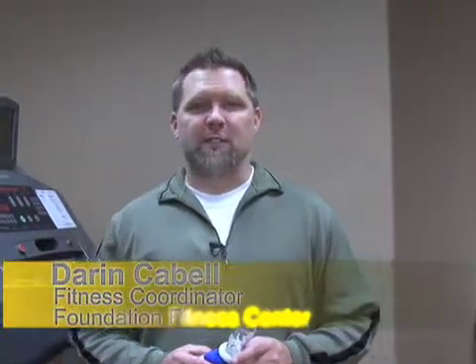Hi, my name is Darren Cavill, fitness coordinator with Foundation HealthPlex. We're going to be demonstrating the VO2 test, or at least giving you a good idea of what a VO2 test looks like. Just like we had a resting test on the last video, using this very mask, we're going to use this mask for an active test.